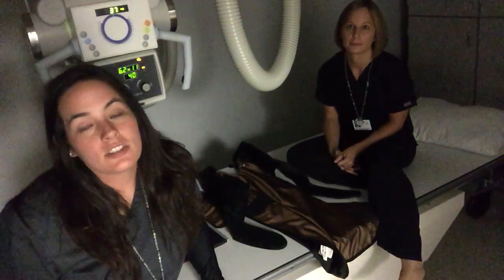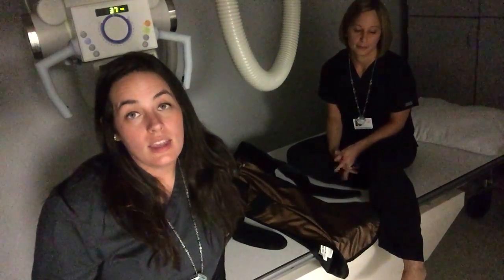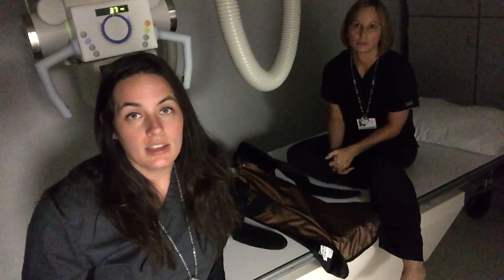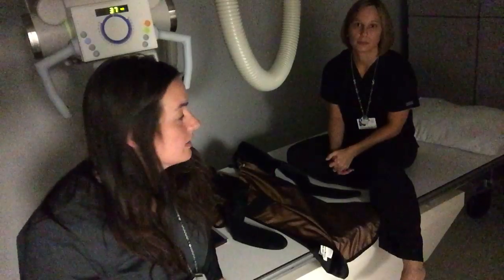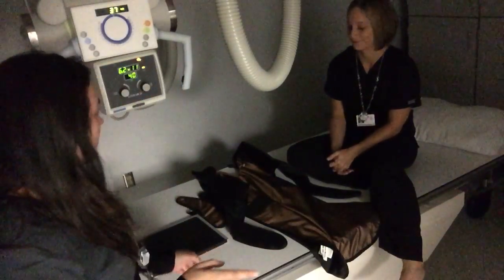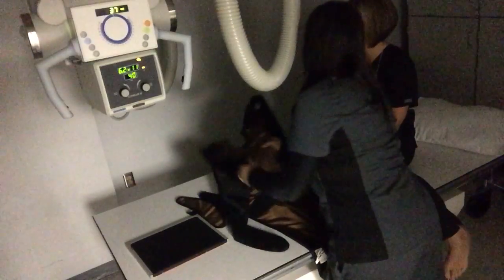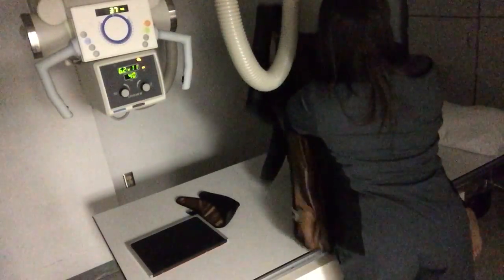Okay, this next instructional video we're going to be doing is the ankle video. We're going to do 3 projections, the AP, oblique, and the lateral. Mrs. Skaggs is going to be my patient. So first things first, I'm going to get her all covered in lead, protect her.